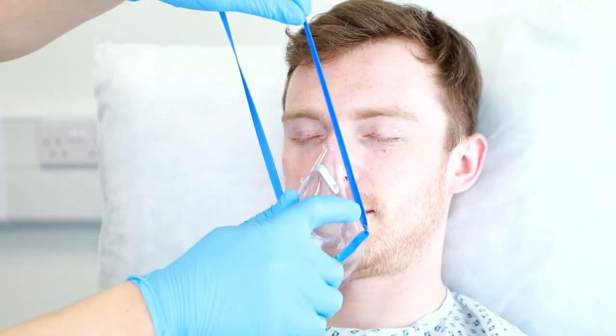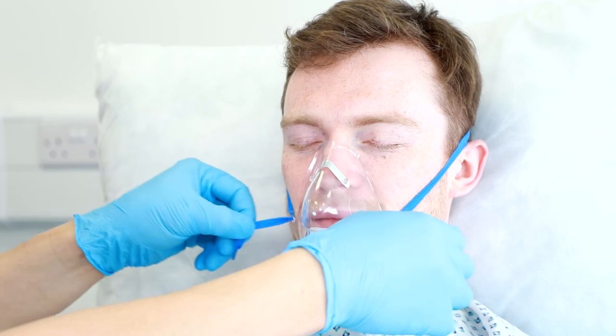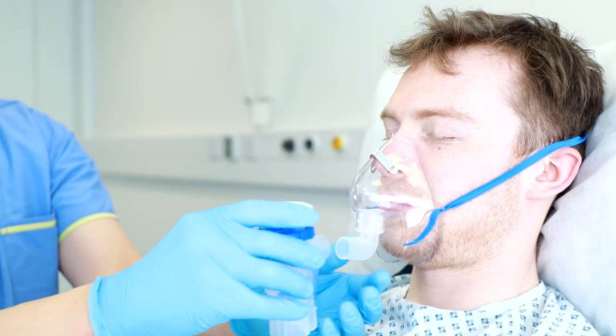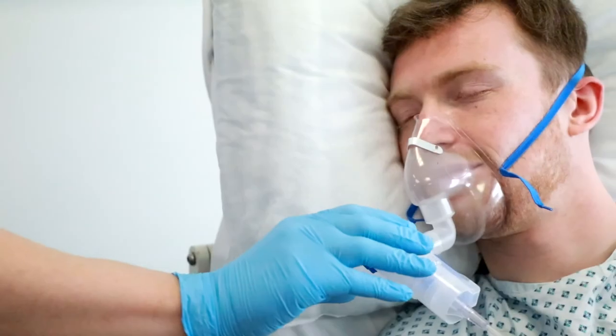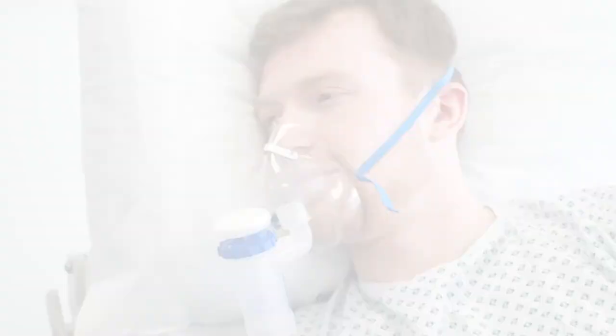When using a mask, position it on your face and pull the strap ends through the front of the mask to ensure a good fit. The mask is closed, so there is no accidental release of medication in the environment. Using the swivel elbow on the mask, the patient can receive therapy in various positions.